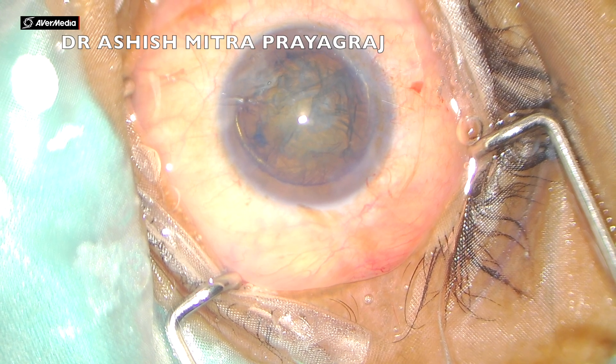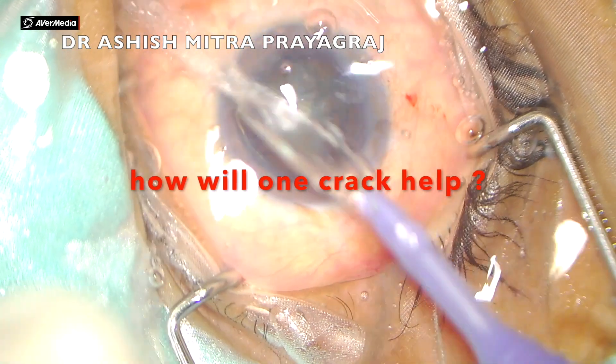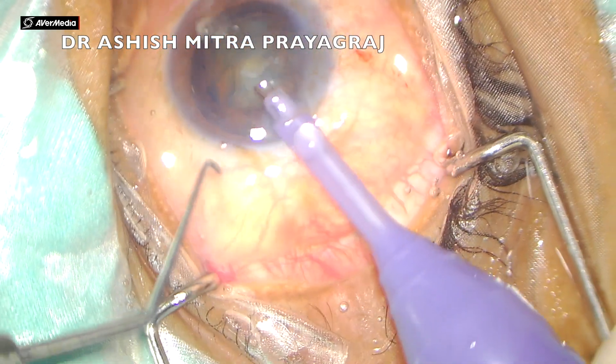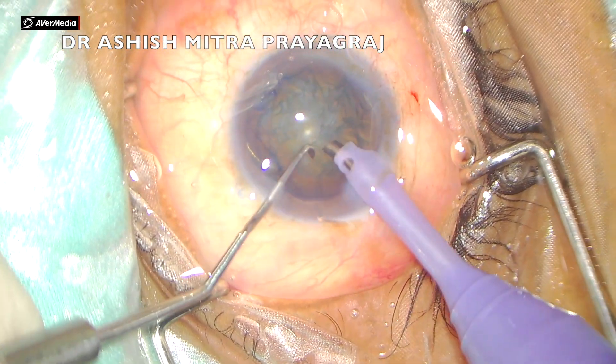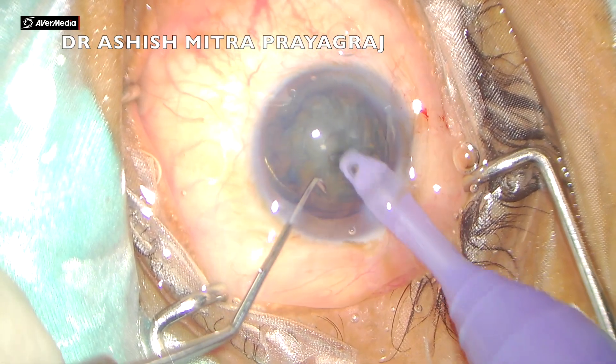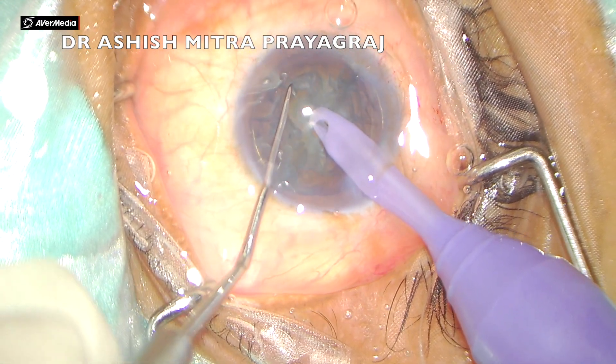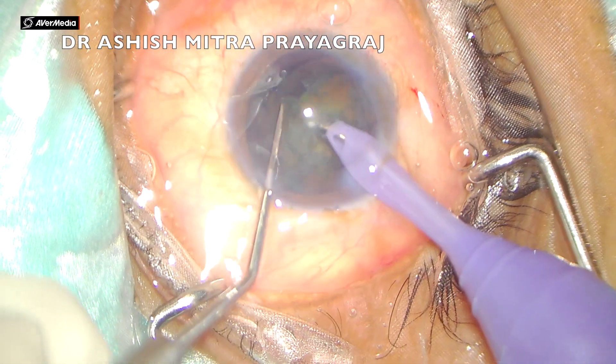The technique we follow in most of our cases is the modified stop-and-chop, wherein I make a small trench. You can watch the tip exposure here — I am just making a very small trench so that I have ample substance to hold.